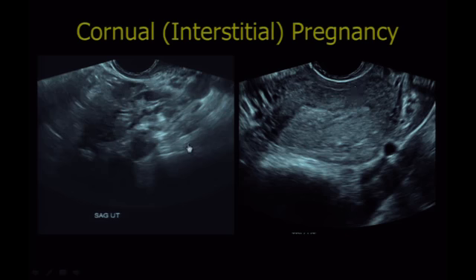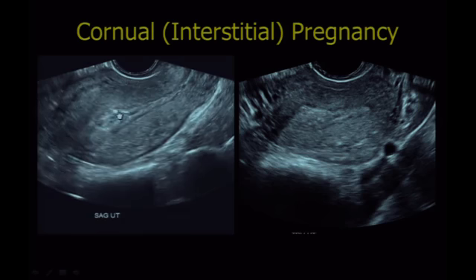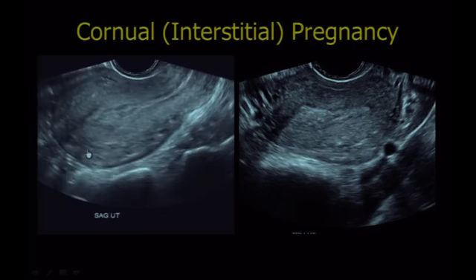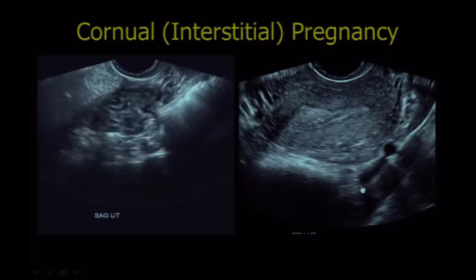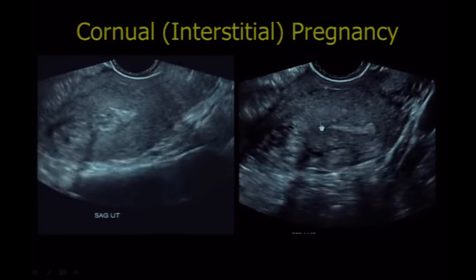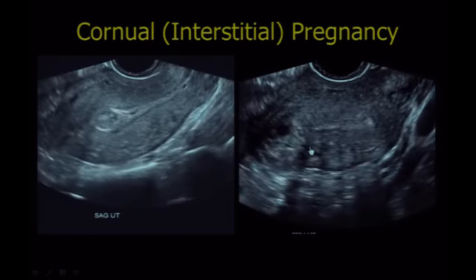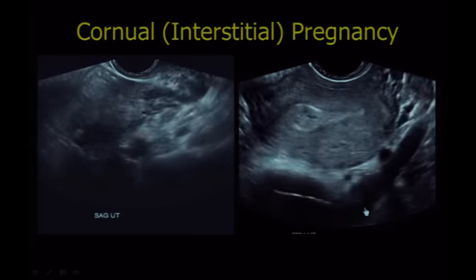So here's a patient with interstitial pregnancy. Here's a sagittal clip through the uterus. In the endometrium, we see a little heterogeneous fluid, no definite gestational sac, but if you noticed on that clip, as we get out to one side, you'll see, in this region, heterogeneous hyperechoic tissue. Here's the transverse or coronal view in the same patient. So here's the mass, some heterogeneous hyperechoic tissue. Not an obvious gestational sac, but this is trophoblastic tissue, and this patient did have a proven right interstitial pregnancy.